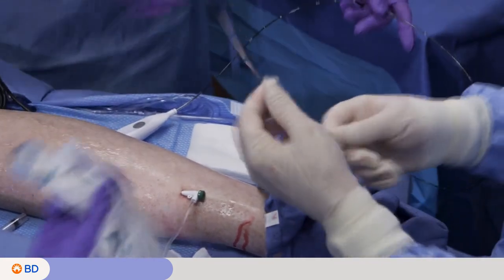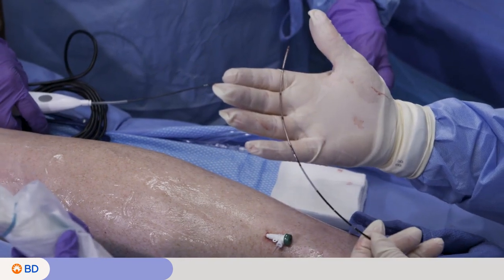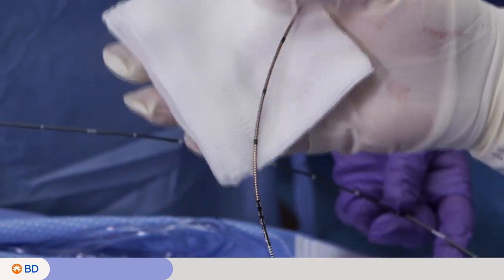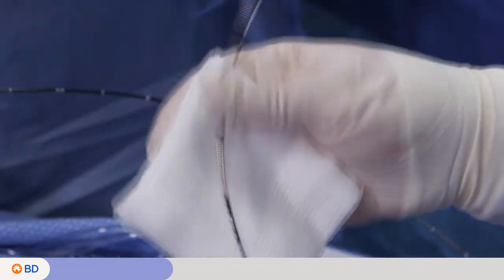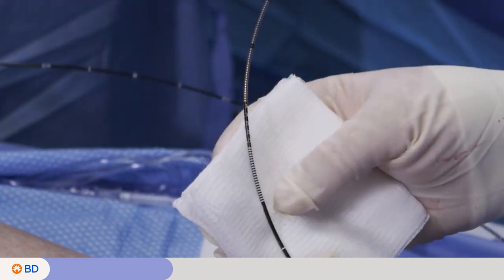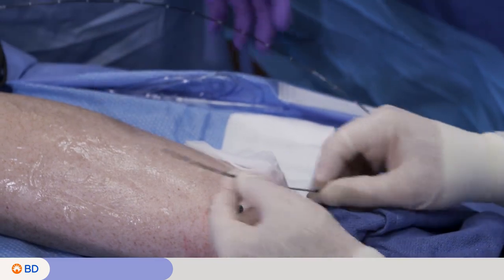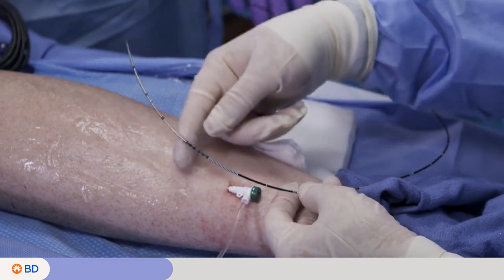The catheter is a six-French catheter with a natural curve, which is very helpful as you negotiate through anatomy — you don't typically have to shape it at all. We have a 10-centimeter heating element and coil with three divisions marking off two-and-a-half centimeters each. There's a warning track with X's at two-and-a-half centimeters and lines indicating you're nearing the end when inside the body. There are also back-end markers that match the length of the sheath, so when it exits you'll know where the proximal end of the coil is positioned in the vein.